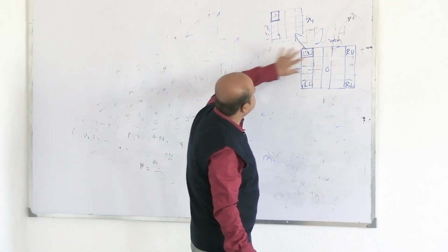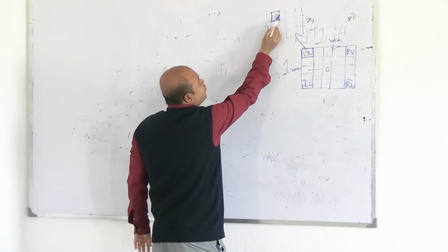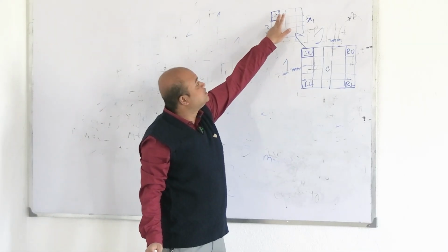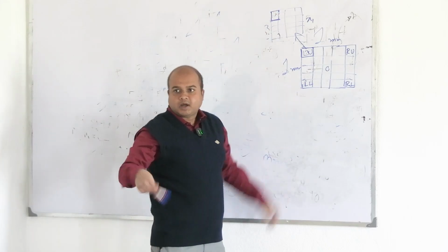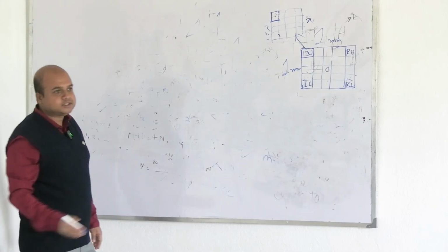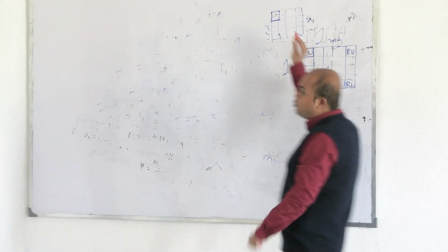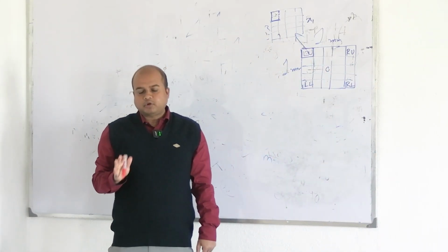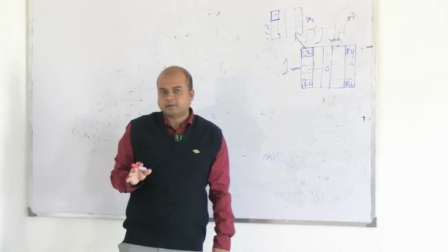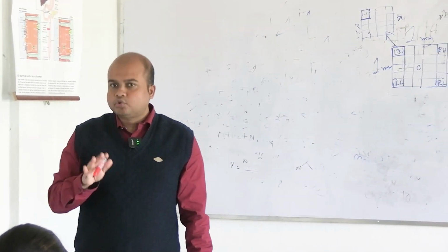So, we are counting 1, 2, 3, 4 like this. Counting these, cells will be lying on the margins as well. Suppose I count 1, 2, 3, 4, 5, 6, 7, 8. But when we count the second square, there is a chance that the cells on this common margin will be counted twice. So, what is followed is a rule called the rule of L. When we count cell number 1, square number 1, here we refer to the cell. Squares can also be termed cells mathematically, but here we are talking of cells as the human body cells, in this case the RBCs. So, let us call them squares.